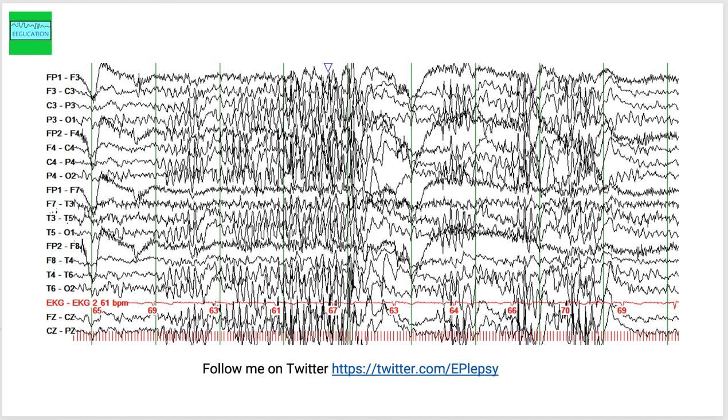...before initiating the flashing lights, you can ask the patient to start counting backwards from 100. And you may see a pause as the photic stimulation starts provoking EEG changes.